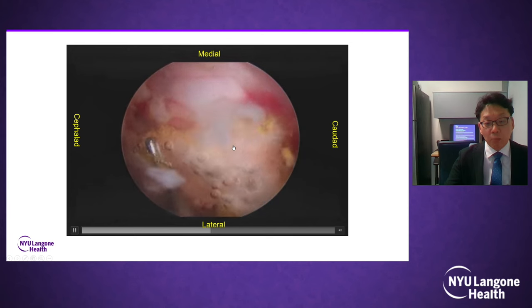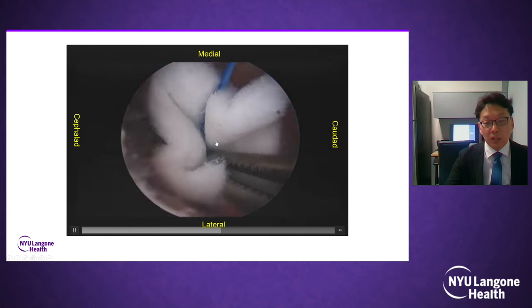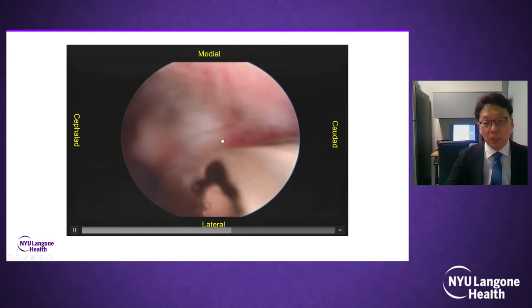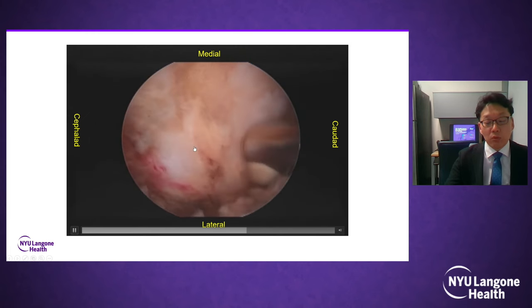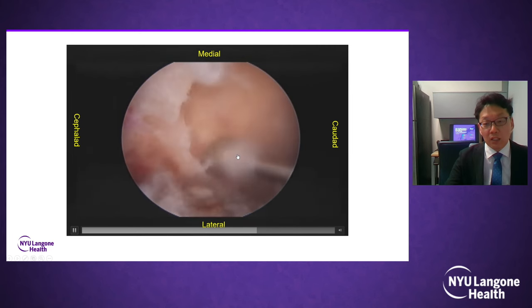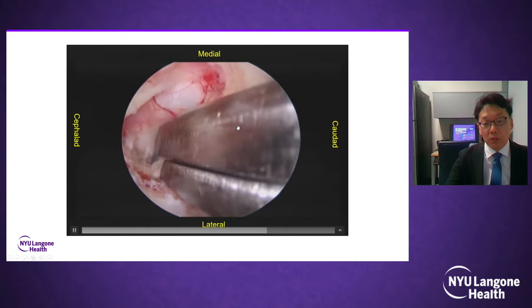After one level is completed, Tachocomb shielding and covering of this with the material to prevent hematoma collection. During the two-level surgery, you can just slide to another level. Then the same procedures are done here.